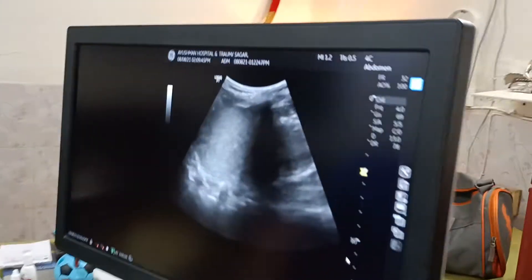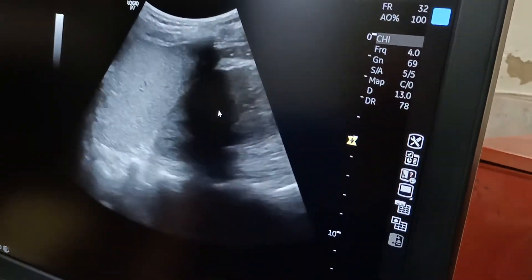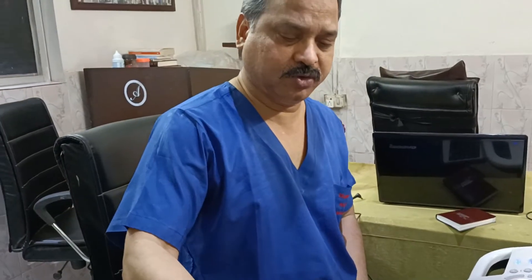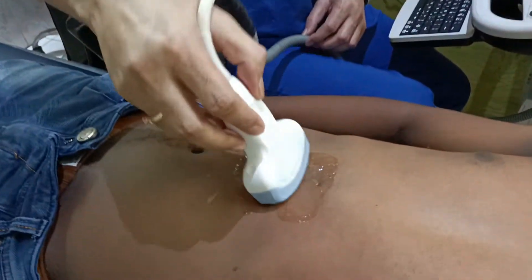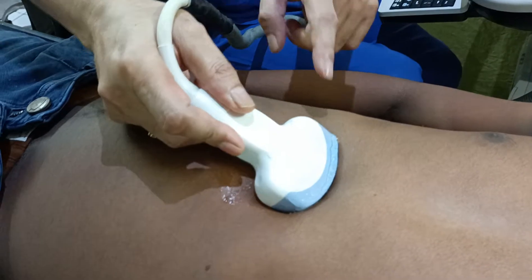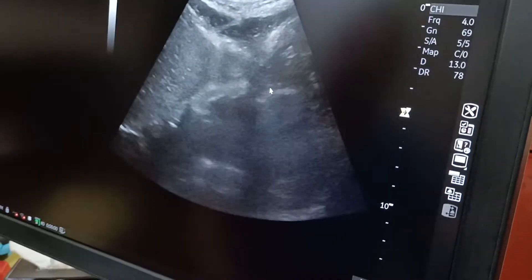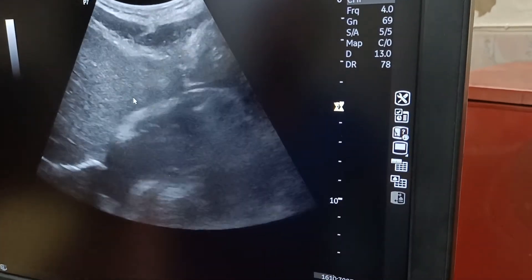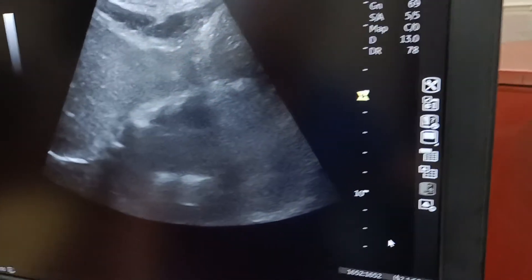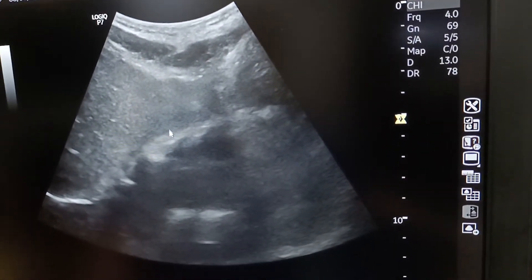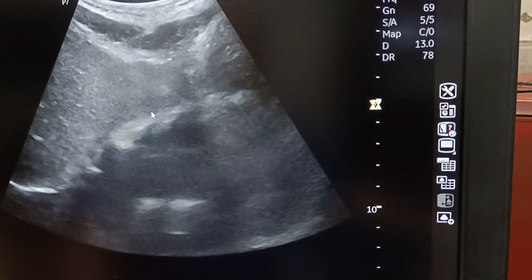Now you can see both structures — this is the spleen and this is the kidney. Now coming to the third view: the subcostal view. As mentioned in the echocardiographic video, just keep the probe below the xiphisternum, and the marker has to be on the right shoulder. Now you can see on the screen good contraction of the heart. This is the liver, and this white structure is the pericardium. In case of hemopericardium or cardiac tamponade, the fluid or blood will get accumulated between the liver and the pericardium.